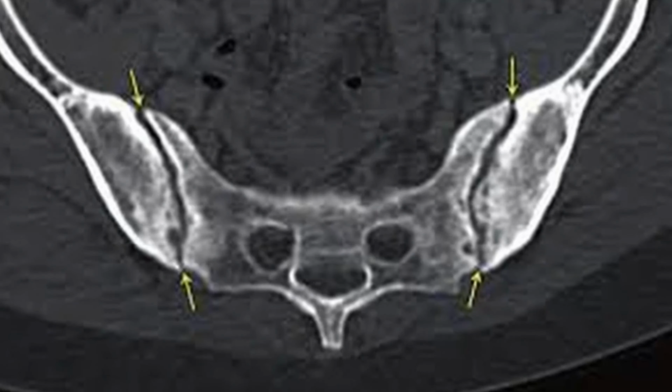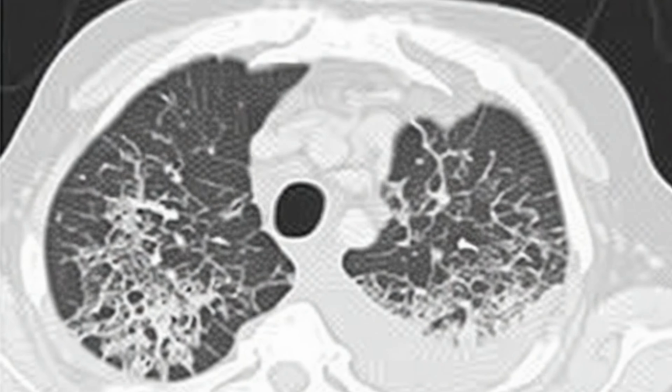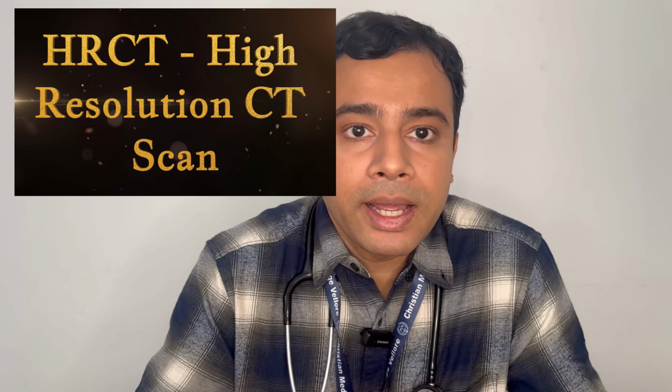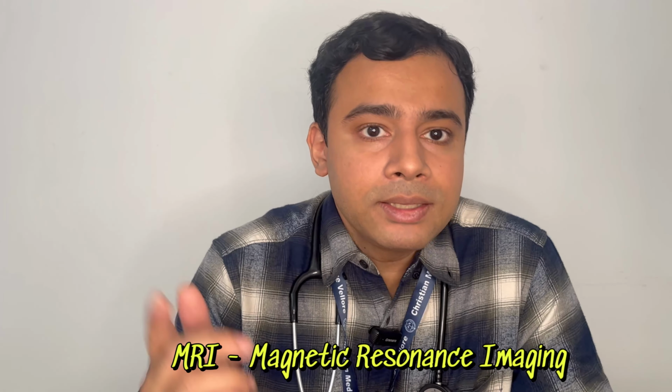Okay, so the next common imaging modality that we use is your CT scan. Okay, CT scan basically is the gold standard for detecting erosions in your bone. Okay, then we also use CT to look at the structural integrity of your bones. Okay, then we use CT scan to detect lung involvement, for example your interstitial lung disease. So here also we do use CT scan, mainly the HRCT, that is your high resolution CT scan, for detecting interstitial lung disease.